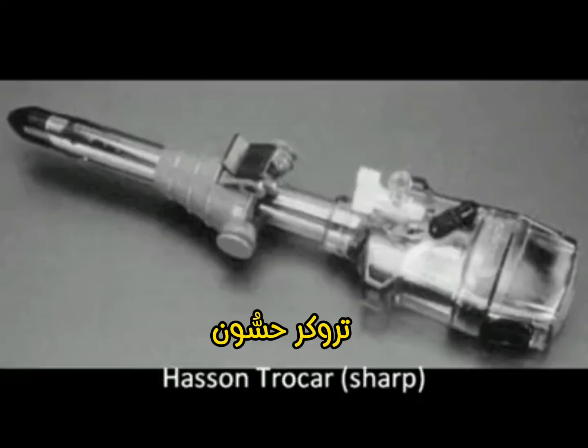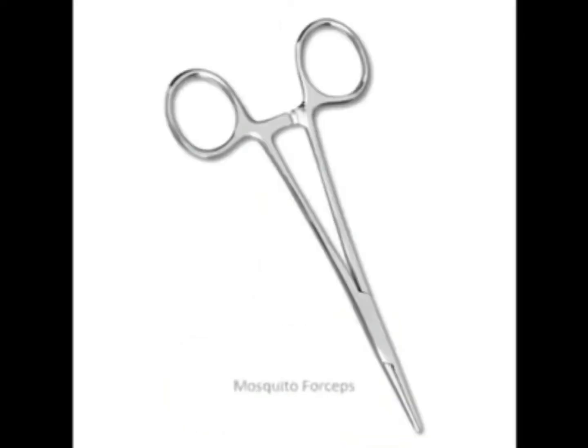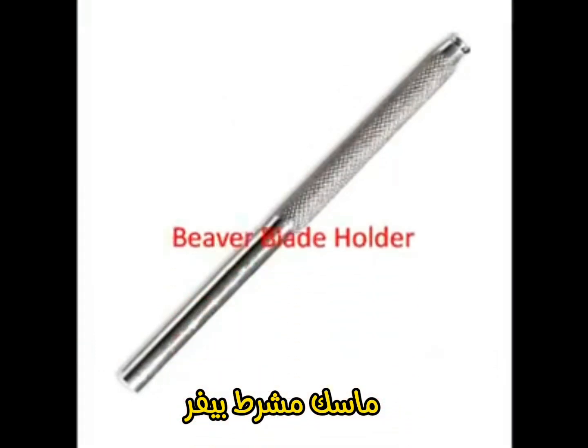Hasson Trocar. Artery Crile Forceps. Hemostat. Mosquito Forceps. Beaver Blade Holder.